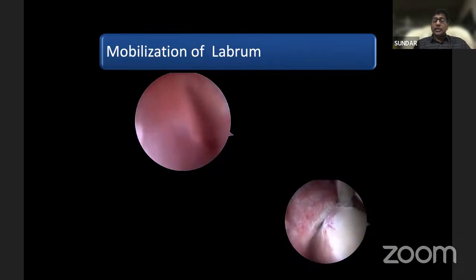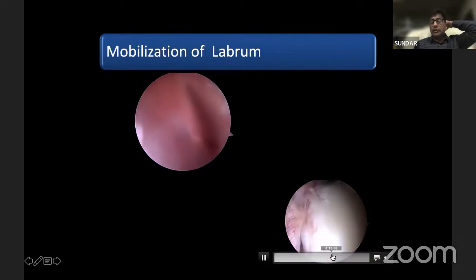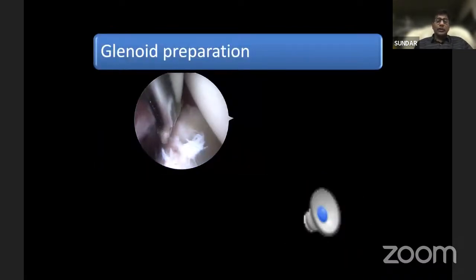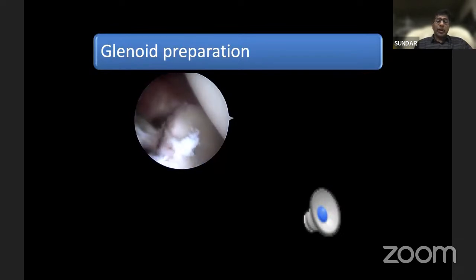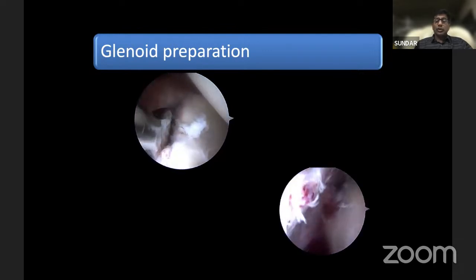And you can see that once you do the complete elevation and you see the subscapularis muscle inferior to that, then slowly the capsule labrum is coming up to the level of the glenoid. From the ALPSA lesion, it has come to the labral level. Once you do that, you can use a serrated shaver or a rasp to prepare the medial part of the glenoid to create some biology over there. That is very important for the labrum to heal in its new position.